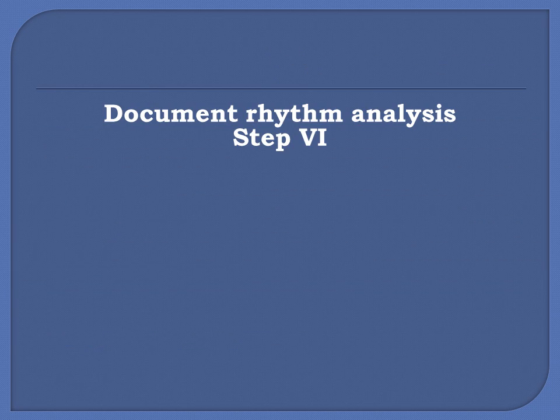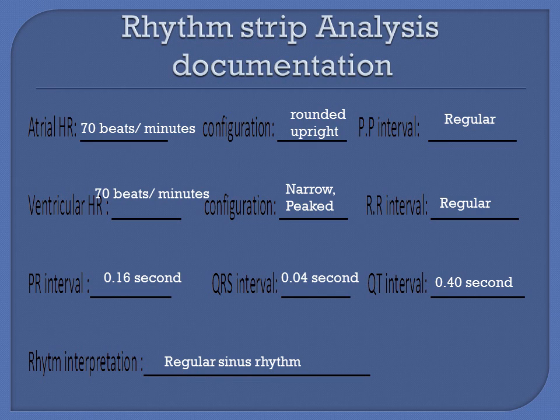Let's move to the last step, which is step 6, and let's document rhythm analysis. In this slide, we will learn to document rhythm strip analysis. This slide is one of the examples of rhythm strip analysis documentation, and in different hospitals you may find different documentation strips. So, if we combine all our analysis of rhythm that is used in this presentation, the analysis will be like this.